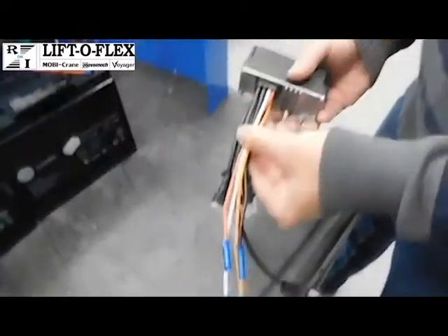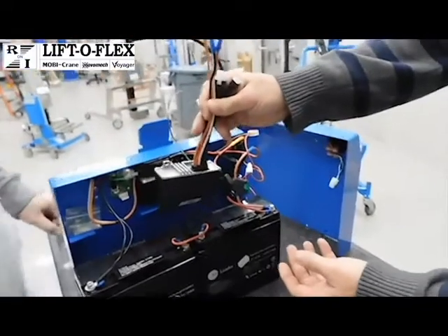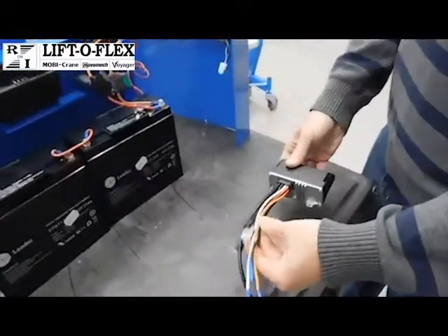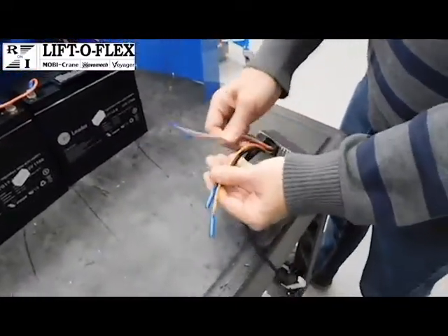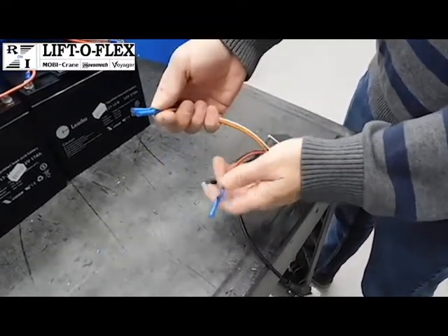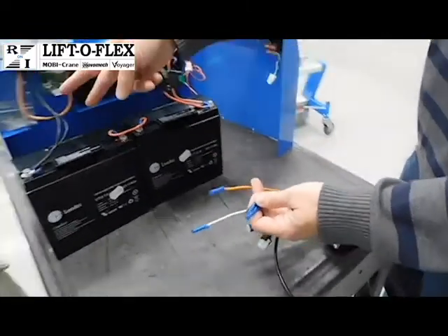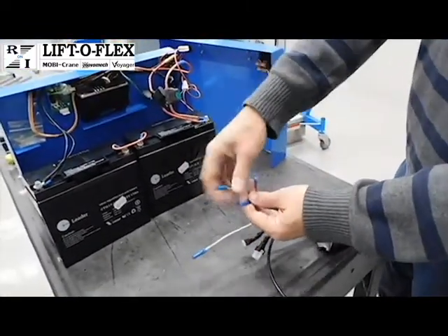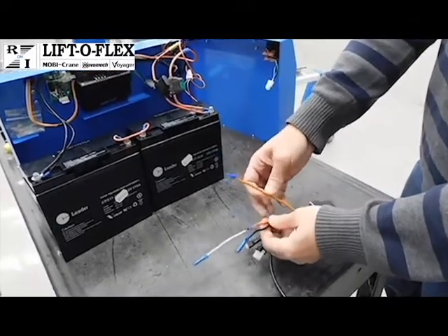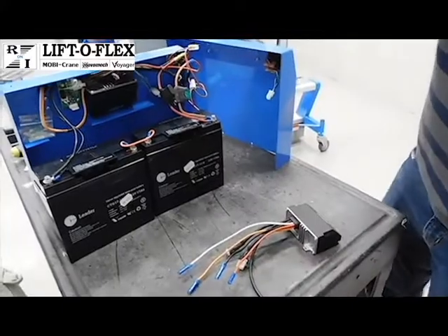Now we're going to remove and replace the Curtis controller. That's the controller that sits inside the power pack. This is how the spare will arrive. It'll have 4 leads coming off of it, and they will all have splice connectors on them, because when this card is replaced in the field, the wires will need to be cut and rejoined to these. We're going to walk you through this to show the removal.